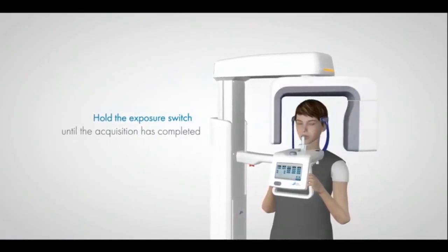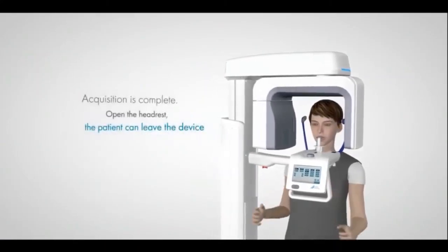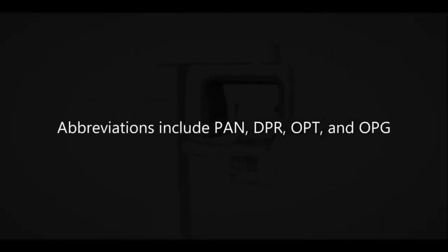Other non-proprietary names for a panoramic radiograph are dental panoramic radiograph and pantomogram. Abbreviations include PAN, DPR, OPT, and OPG.